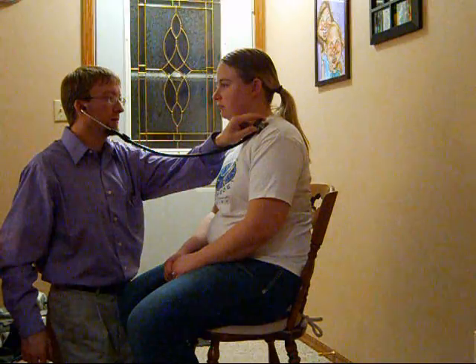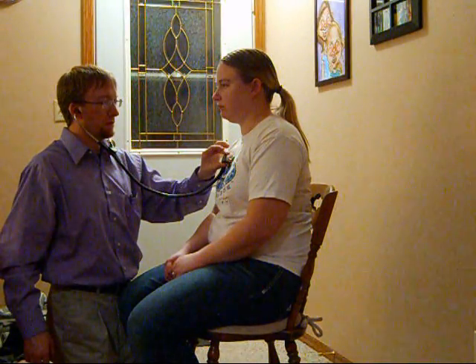Moving on to the front, I'm going to start with palpation once again. And then auscultation with the diaphragm. Hearing bronco-vesicular here. And vesicular sounds here. I would listen all over the lung fields.